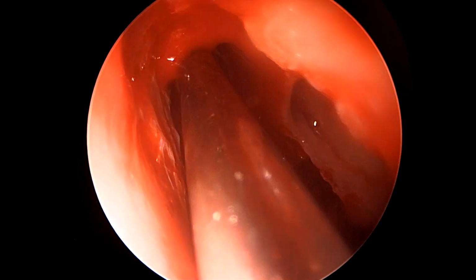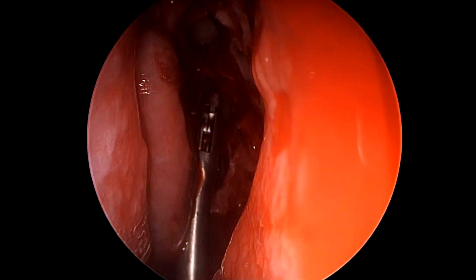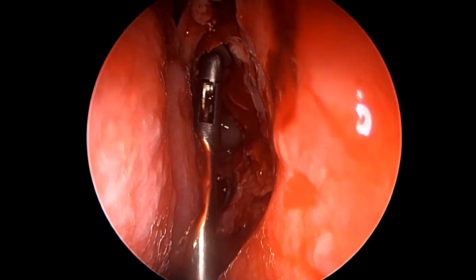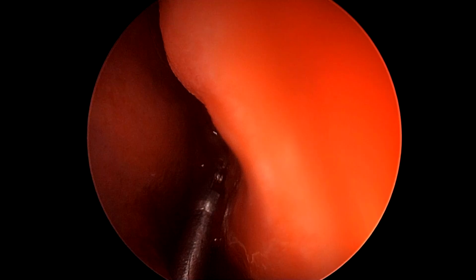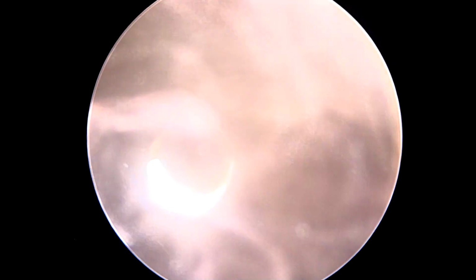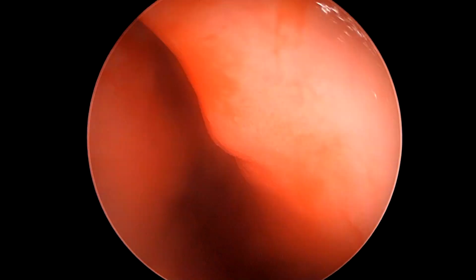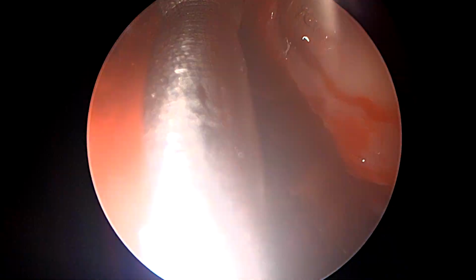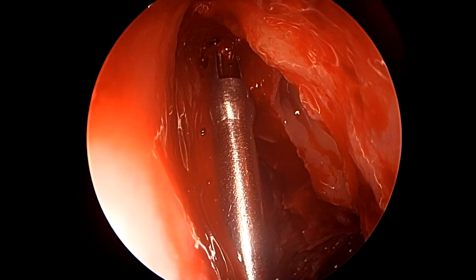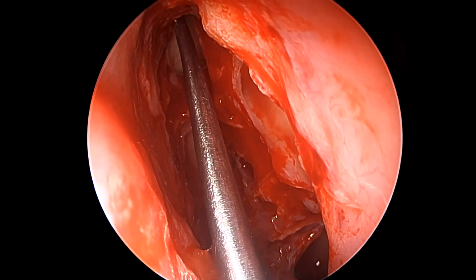But here we are just trying to gently take our frontal sinus seeker or any ball probe between the actual frontal sinus and the anterior wall of the frontal bullar cell to remove this. And this wall can be removed after fracturing with a simple giraffe forceps, which opens straight and not sideways. So there's importance of both the straight and the sideways opening giraffe. Here we are following the frontal beak, and we are removing the party wall, the so-called anterior wall of the frontal bullar cell.